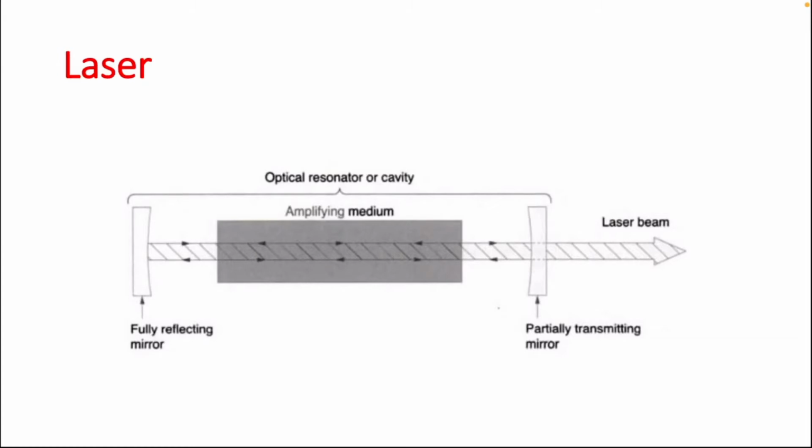The mechanism is stimulation of the amplifying medium to produce a high intensity beam of light that will be bounced forward and backward between these two reflecting mirrors and intensifies into one highly directional, high energy beam of light that will be exiting from the partial transmitting mirror. But the laser makes use of processes that increase or amplify light signals after those signals have been generated by other means as well.